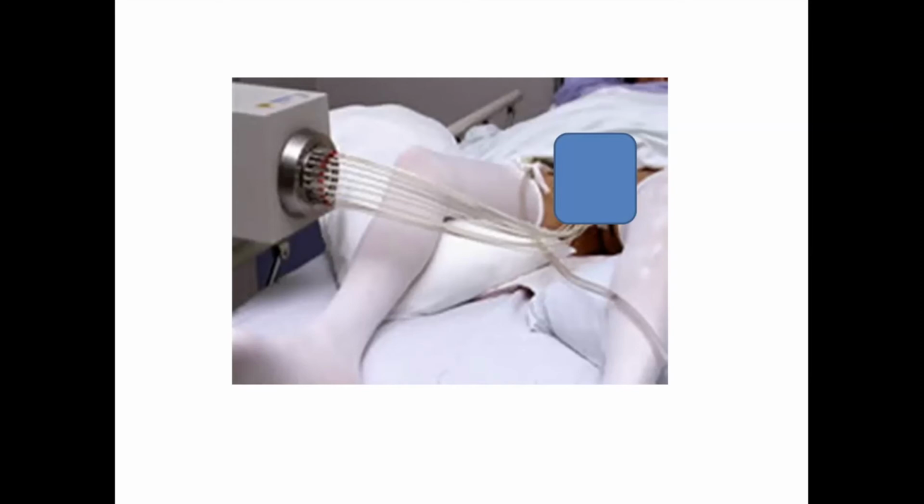The key thing there also is that once you've taken a catheter out, what you want to happen is for the patient to be able to wee themselves successfully. And they need to wee a couple of times to prove that the pipe is clear and that there's no clots blocking the way, so that then hopefully we can send the patient home. So the aim and the hope is that it's a day case treatment.